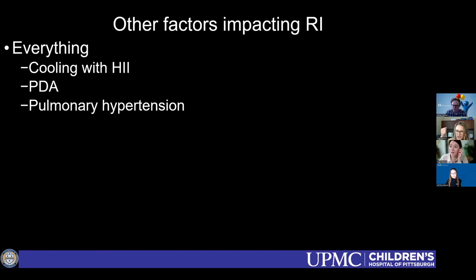Do you do the compression? I know in some studies it's like, you compress if it's less responsive or there is less RI change. I trained in Boston, which means I trained with George Taylor. So I am a true drinker of the compression RI Kool-Aid, because he is also a firm and true believer. I did that at my initial practice at the University of Wisconsin, and it's very helpful.